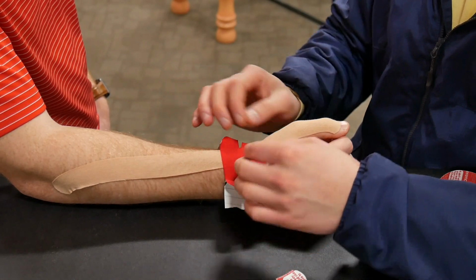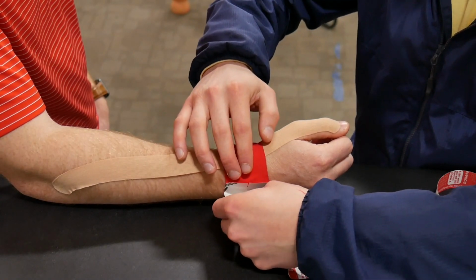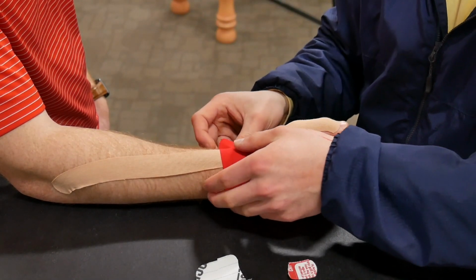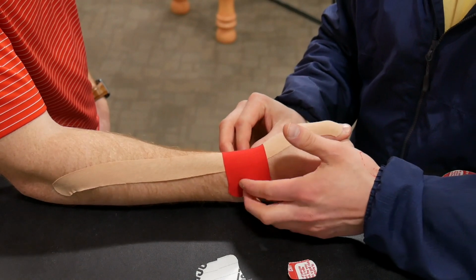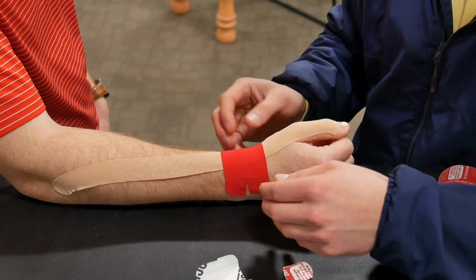And then that's sitting there, right? Okay, so the central portion is there, rubbing that in, and then you just peel the paper off and you stick down the last bit, those two tabs on each side, with no stretch. So the last two tabs get just pressed in. And the reason that we cut the little slits is just to allow them to flex and extend their wrist without this tape bunching up. That's why you have the slits.